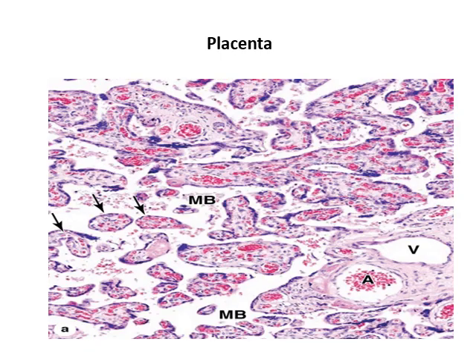Here is the placenta formed of the chorionic villi containing the fetal circulation, Hofbauer cell, and the syncytial trophoblast, and this is the maternal blood.